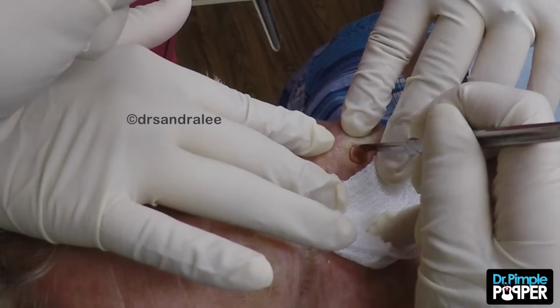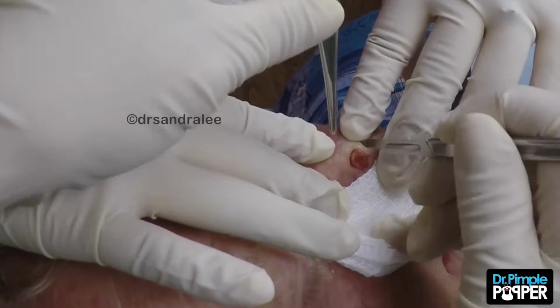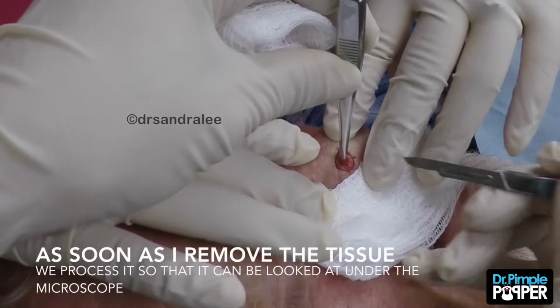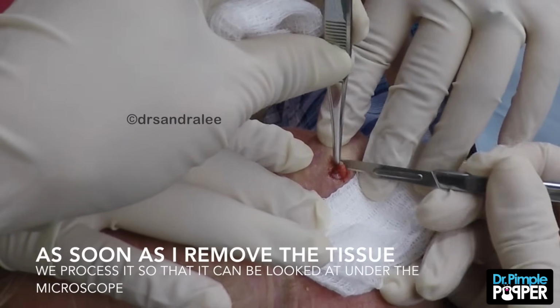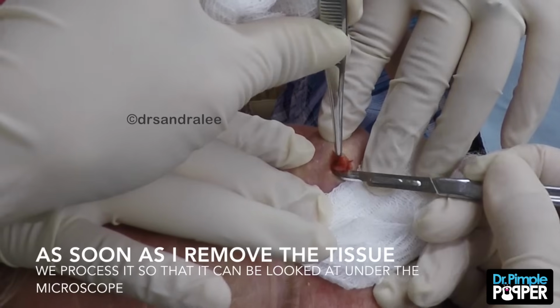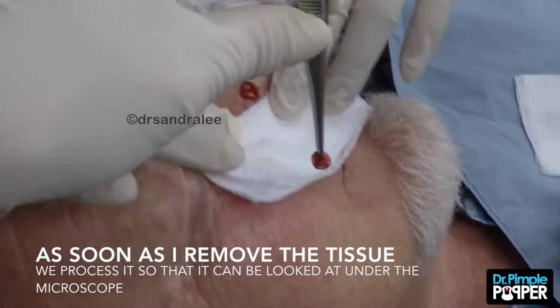We'll be able to check the tissue. Right next door, we have Rachel who's processing the tissue. She's going to put it on a slide so that I can look at it under the microscope. Then we'll be able to see all the edges and down deep to see whether it's clear of skin cancer or not.